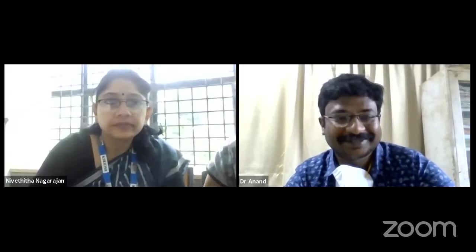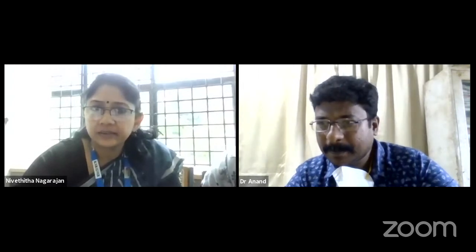Thank you so much, sir. Anand, I have a question. Is there a machine currently available with different FOVs? Yes, sir, we have it. Kodak Carestream has come up with different FOVs. I mean, with smaller FOV and less exposure, or will the exposure be the same? No, sir, there are machines with lesser exposures also.